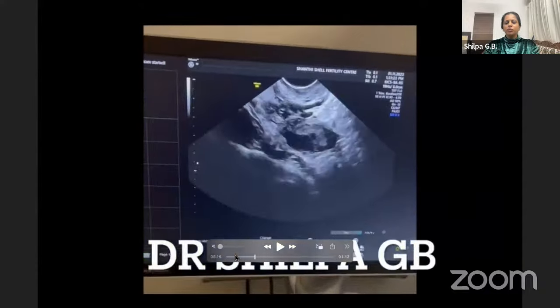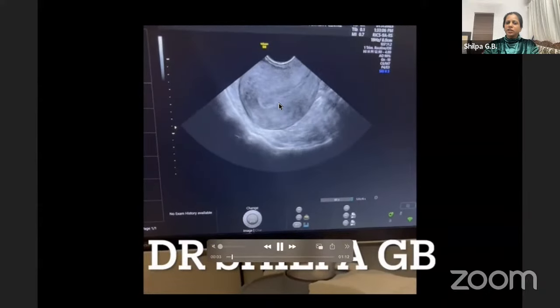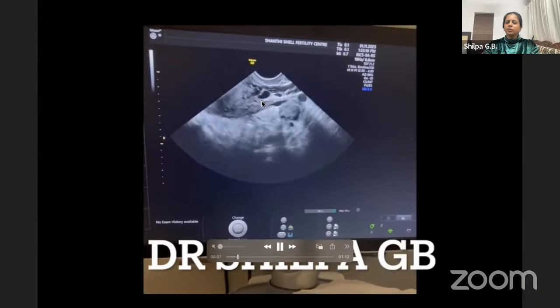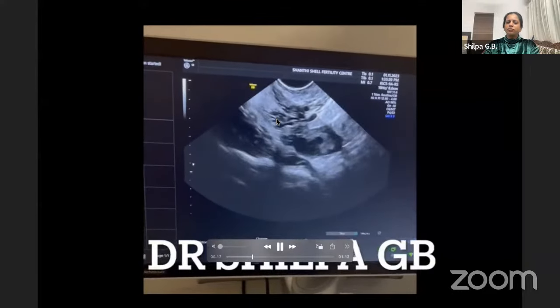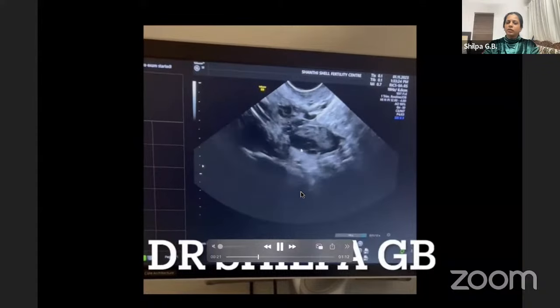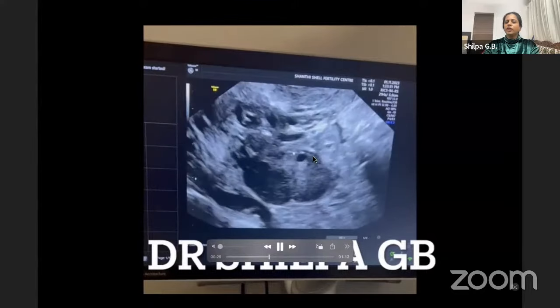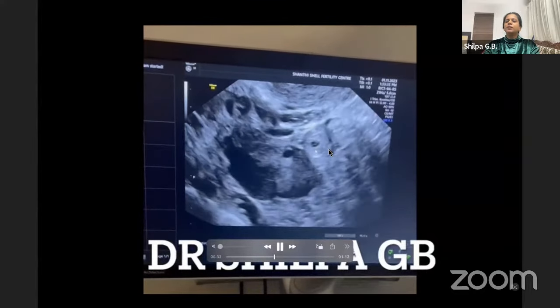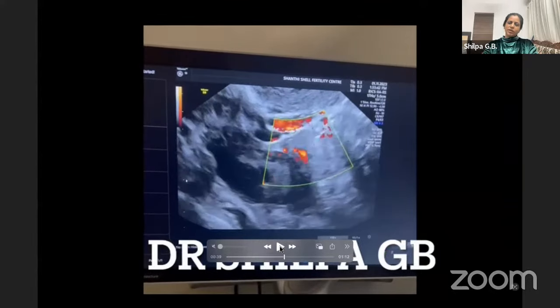Going back to this video - how do we look for ectopic gestation? First you have to rule out the presence of an intrauterine gestational sac when the pregnancy test is positive. If the urine pregnancy test is positive and you don't see a gestational sac, first image the uterus in the sagittal section and then do a transverse section. If you cannot see a gestational sac in the uterus, that is when you need to have high suspicion of tubal ectopic. Sweep the probe to the right and left and give more time to image the area between the ovary and uterus where the sac will usually be seen.